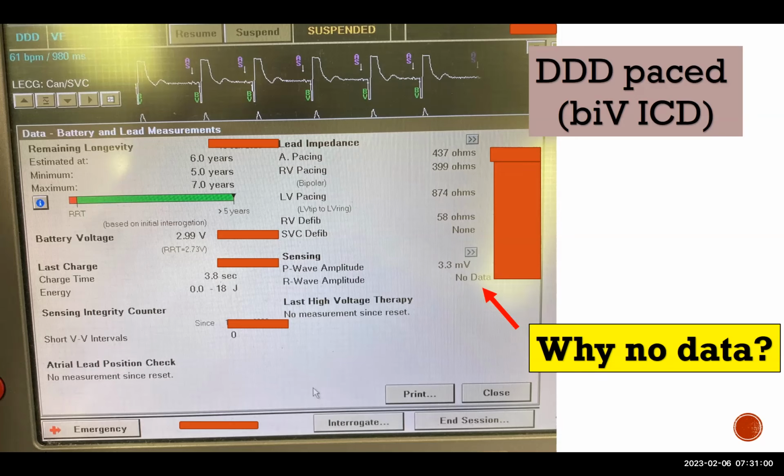And so if you had a patient who was in complete heart block but had an underlying escape rhythm of 40, it wasn't such a big deal. But if you had a patient who had no escape rhythm, it would be a little scary when you would take the device out. So you would have to be ready, with your screwdriver, to immediately unscrew the lead and attach it to an external pacemaker temporarily in order to maintain an adequate heart rate during the procedure. So that's the reason why we don't have an R wave.